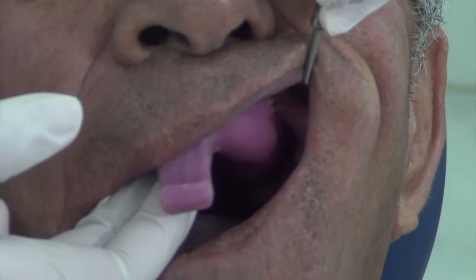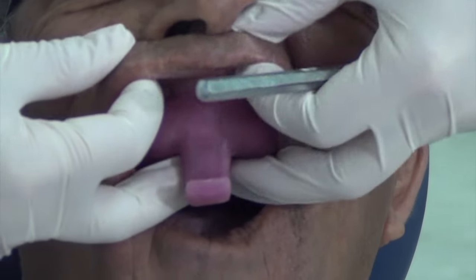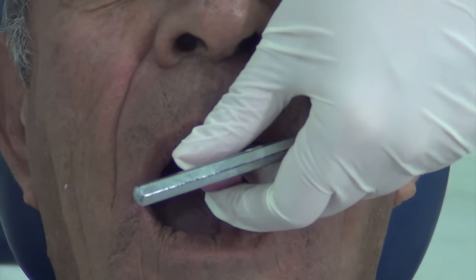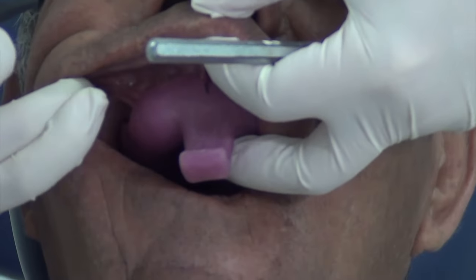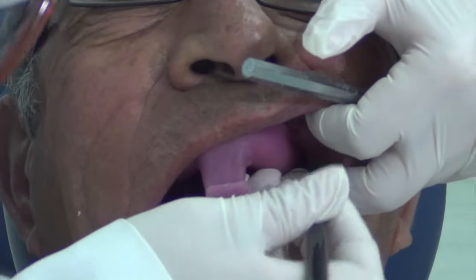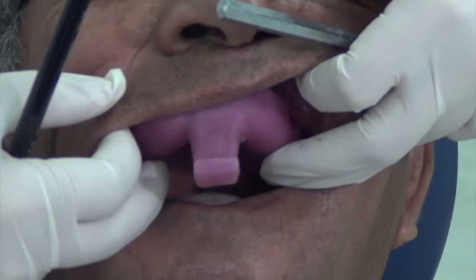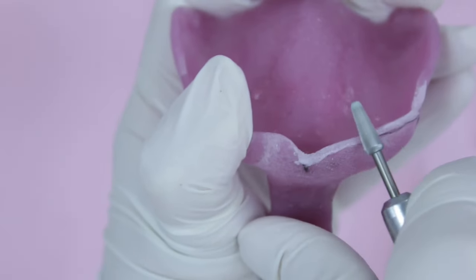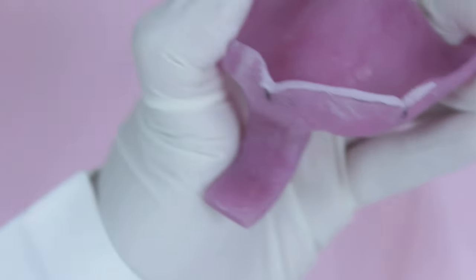Notice how more relief is required for the buccal frenum and the tray borders are slightly over-extended labially, so they need to be made shorter by one to two millimeters. Use an indelible pencil to mark the buccal and labial frenum and the over-extended borders. Trim away over-extensions using a chairside straight handpiece and an acrylic burr, trimming just until the previously marked line.